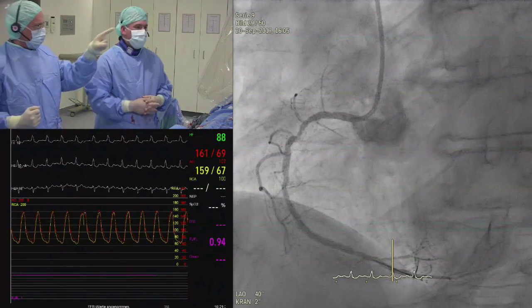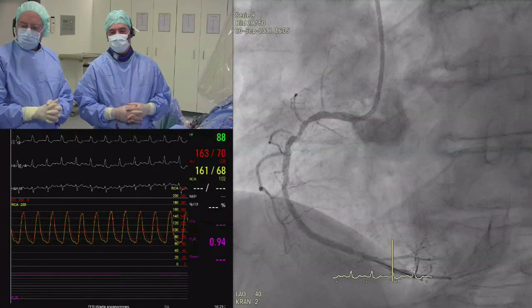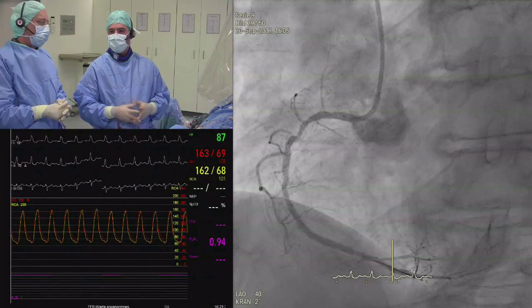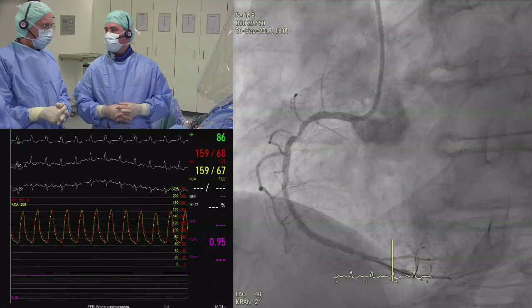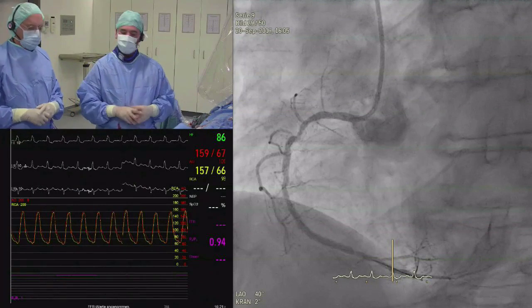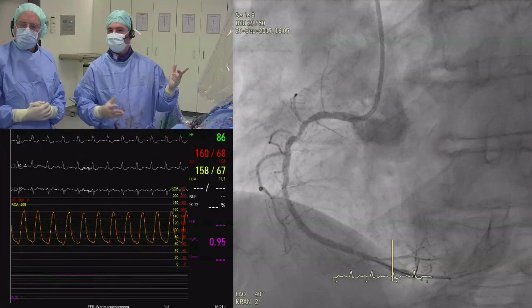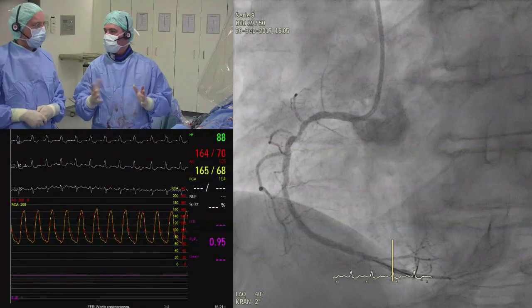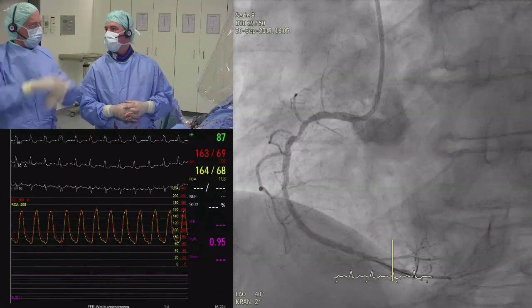Now, are we going to just direct stent this, or no? We're going to balloon it. I'm pretty sure there might be a lot of calcification. So I would go for a 2.0 by 12 millimeter non-compliant balloon to have nice pressure, to have a good idea what size it is. I guess it's a 2.75 stent at the end of the day. I would be comfortable with that, or 3.0, so we can get some idea how it looks when it's up.